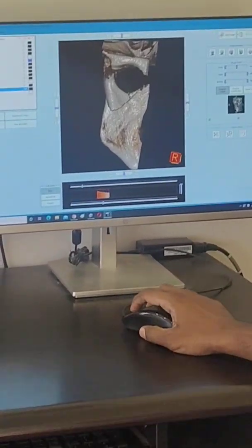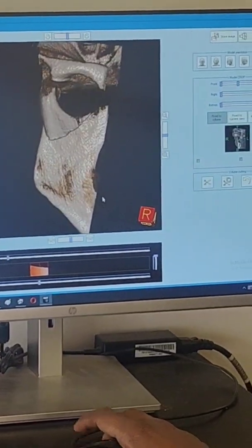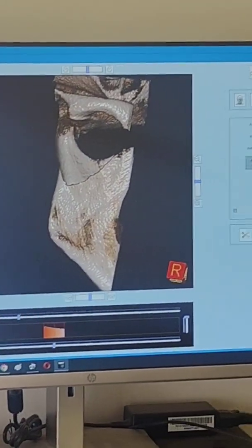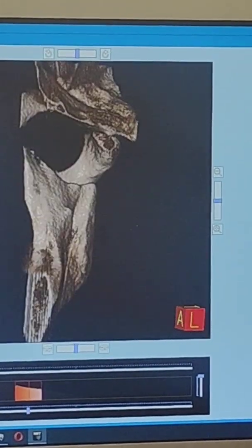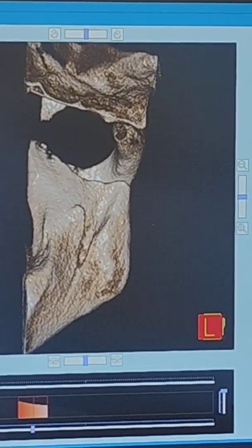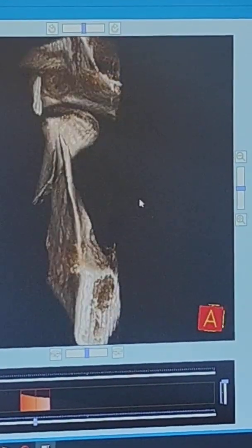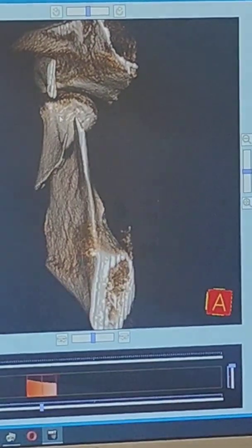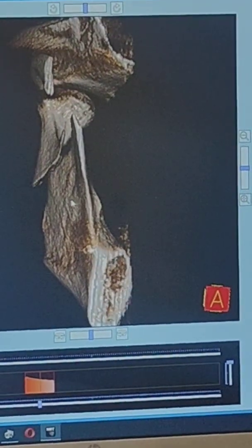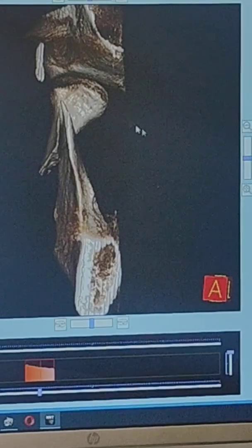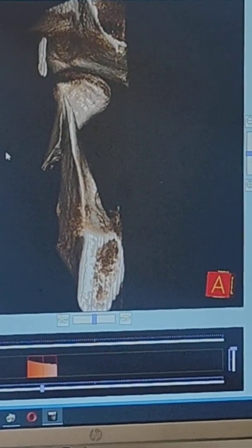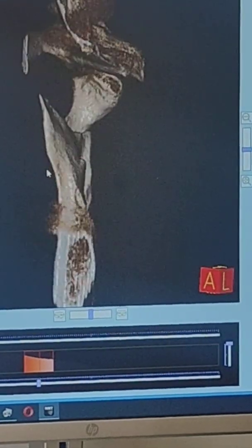Let's look into the cone beam CT image of a patient with subcondylar fracture. This is a 3D reconstructed slice where you are seeing the lateral aspect of the condyle ramus, and we would be going into the medial aspect of the mandible. You can see a displaced subcondylar segment along with the head of the condyle — it is overridden and you can see a tilt. The condyle is basically moving medially whereas the rest of the portion is slightly laterally tilted.